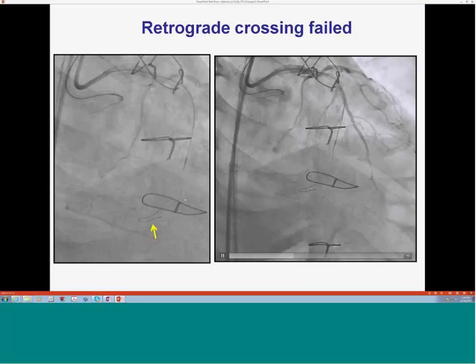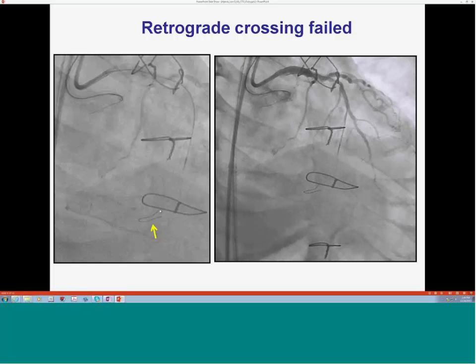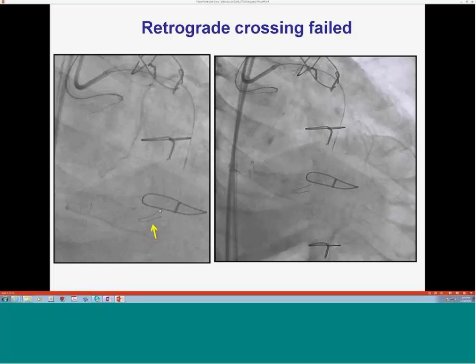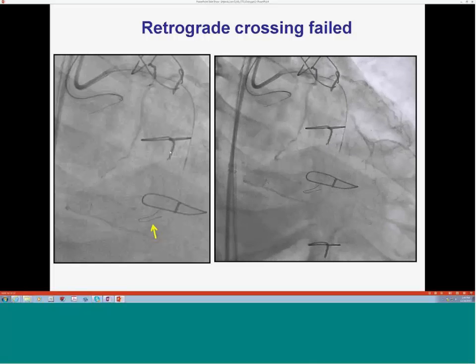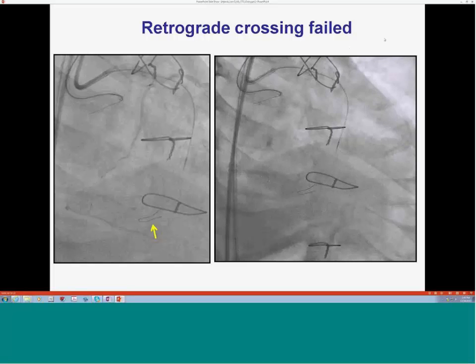And you'll see here the wire would go down and would just buckle just before getting into the PDA. And even in Japanese hands right now, I think the rate they quote is 80% crossing success. So 20%, 1 in 5 collaterals, people cannot cross either because of tortuosity or not a good channel or other problems. So this is not frequent, but it can happen.